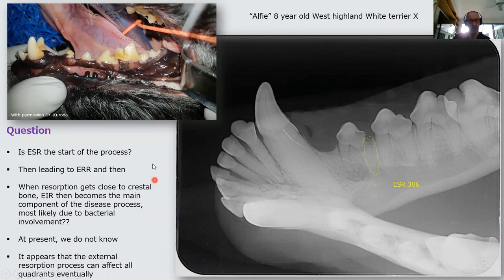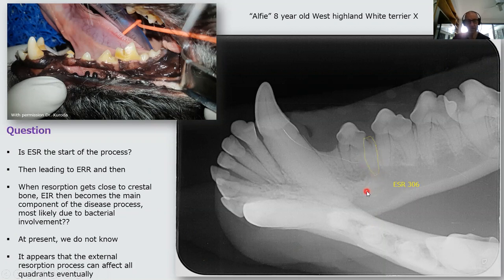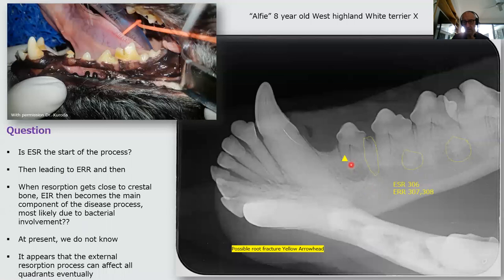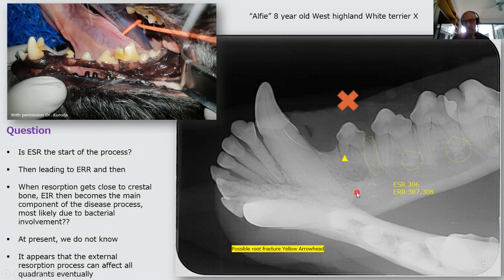Another case showing resorption in quadrant three: external surface resorption is present around the distal root of 306. Surface resorption and replacement resorption are also occurring around 307 and 308. Additionally, a root fracture is visible — a radiolucent line running through the root. This tooth would need to be extracted.